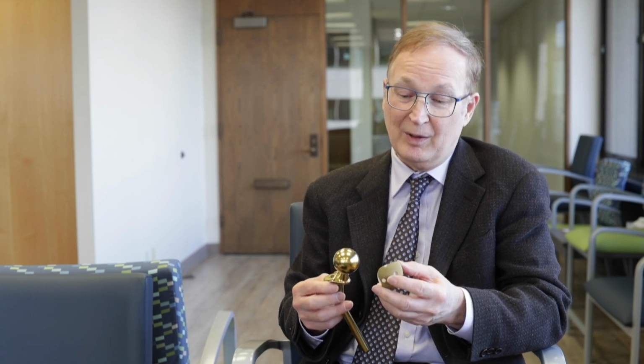So even though this process we've been using since 1989, in her case since 1994 when I put it in, it works. And it works for as long as you need it in the body, 25, 30 years. I thought it was timely now, since in the fullness of time we can see this in ways we couldn't. At first I thought it was a nice side benefit of the implant, which was a good implant anyway, and it had good wear characteristics. But the lack of tissue reactivity has been the most important aspect. We've received a few back 25, 20, even as much as 30 years later now, with no reaction in the tissue. And those are donated implants that we get at the time of retrieval, and never seen a problem with it.